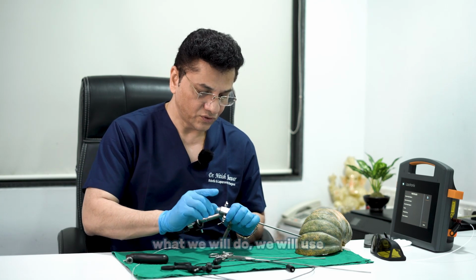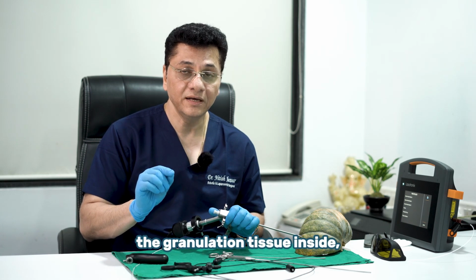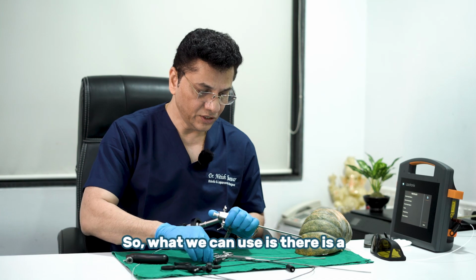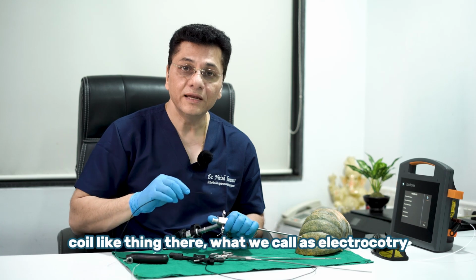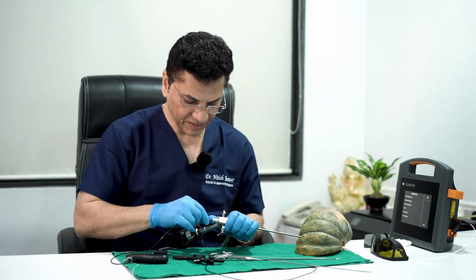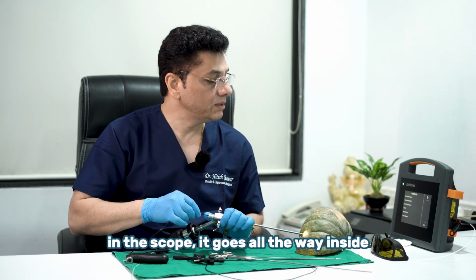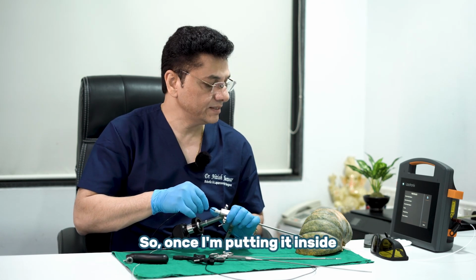And then afterwards, we'll use one of the energy sources to burn the granulation tissue inside, which is the main culprit in causing the fistula and not allowing it to close on itself. So what we can use is a coil-like thing, what we call an electrocautery, and this particular wire can go through the scope inside, and again, as I said, this will go under vision. So once we start threading it through the sheath in the scope, it goes all the way inside, and then it will come into view. So once I'm putting it inside, you can see it.